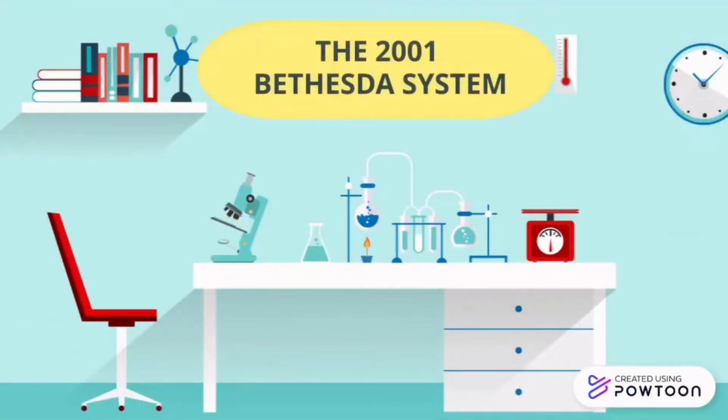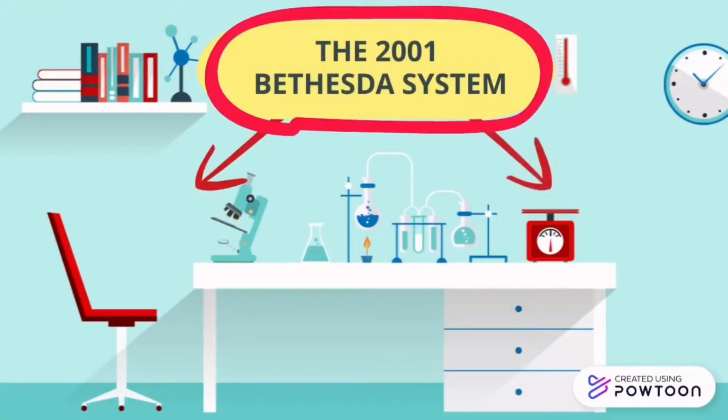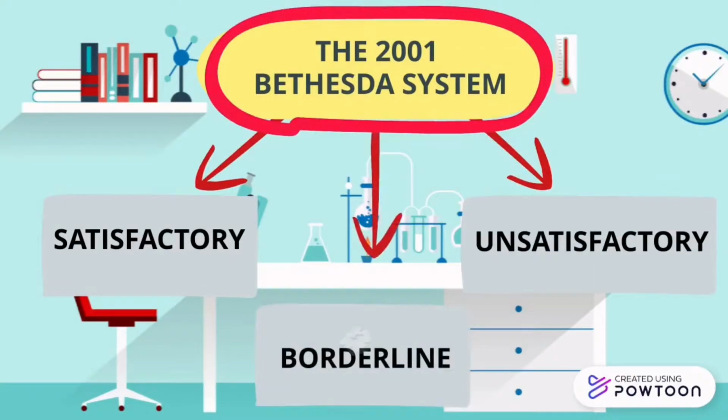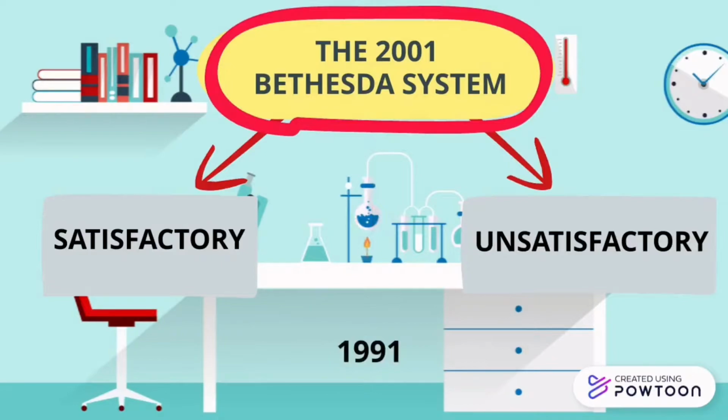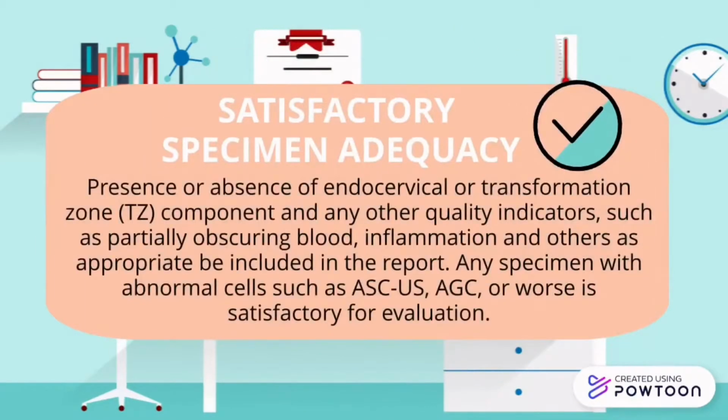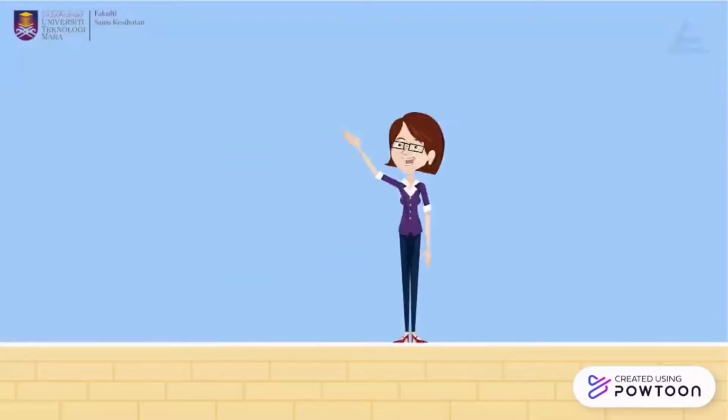Based on the 2001 Bethesda system, specimen adequacy is categorized into satisfactory and unsatisfactory only, which eliminates the borderline category from back in 1991. Satisfactory specimen adequacy is described as the presence or absence of an endocervical or transformation zone (TZ) component, and any other quality indicators such as partially obscuring blood, inflammation, and others as appropriate should be included in the report. Any specimen with abnormal cells such as ASCUS, AGC, or worse is satisfactory for evaluation.